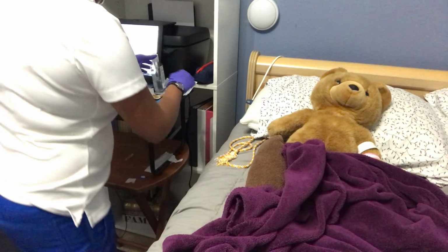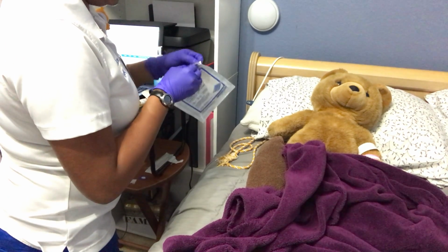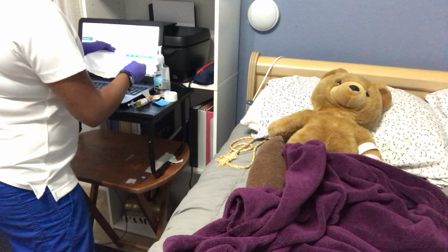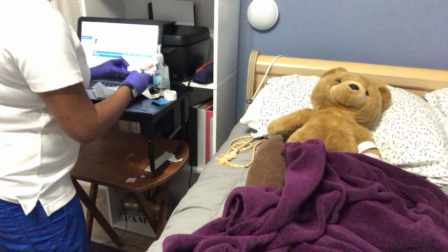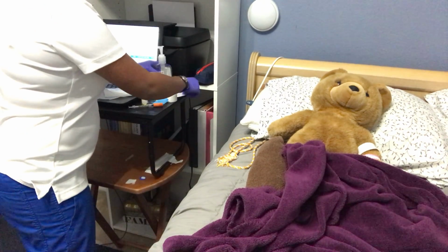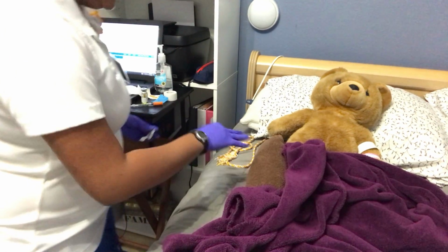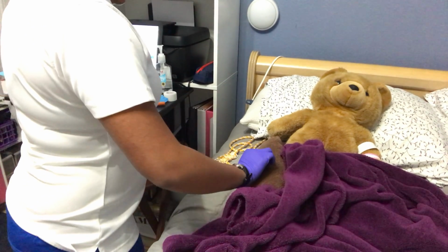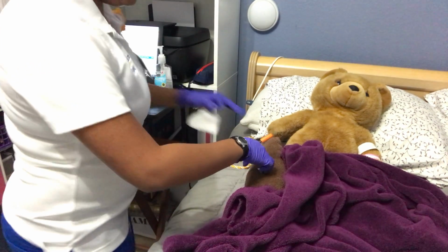Alright. I'm going to make sure that my gauze is open in case we're bleeding. Okay. I'm going to take this out. Alright. Next thing I'm going to do is get the alcohol pad and clean the anterior aspect of the thigh. Okay. It's clean, it's dry, but I'm going to clean this. I'm going to do a circular motion. Next, I'm going to get also the gauze and put it in one hand.